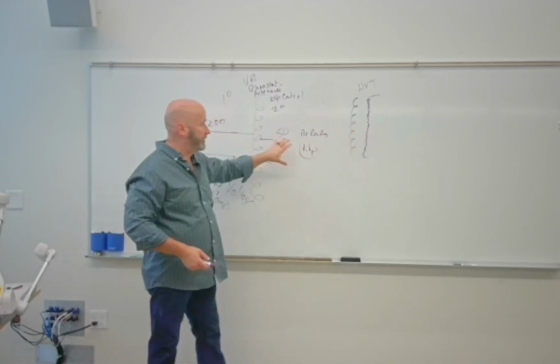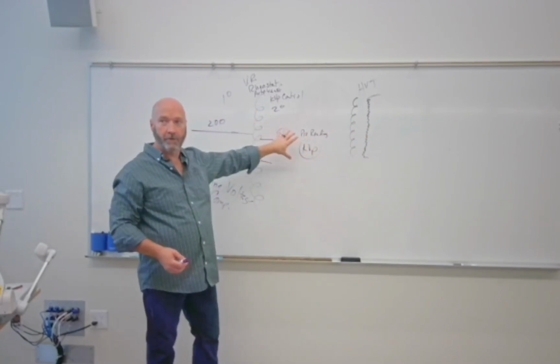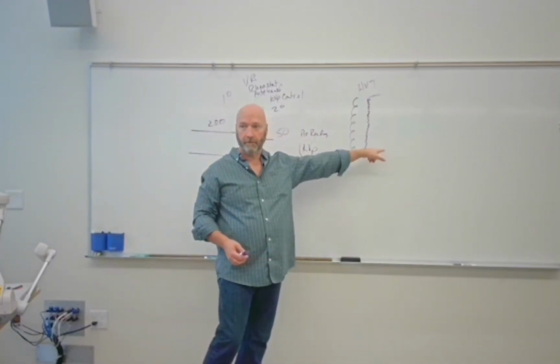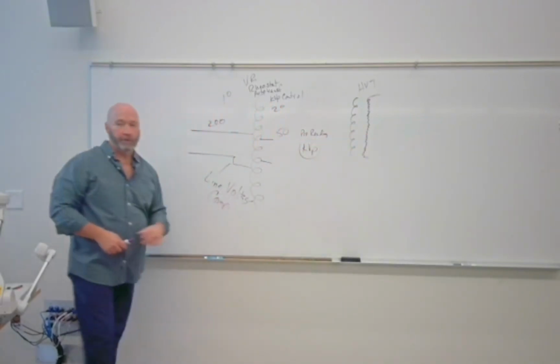So is it a problem that we're reading this and calling it kVp? The answer is no, because if this is showing us what it's supposed to be, we know what it should be over there. It's never going to change, right? The amount of increase is never going to change. So it's pre-reading kVp.